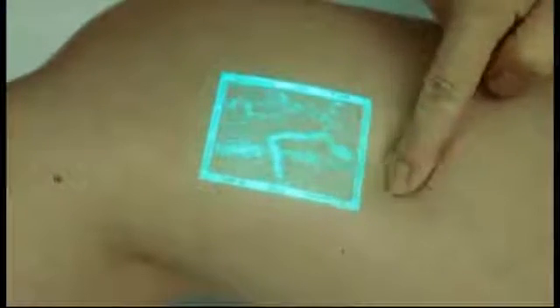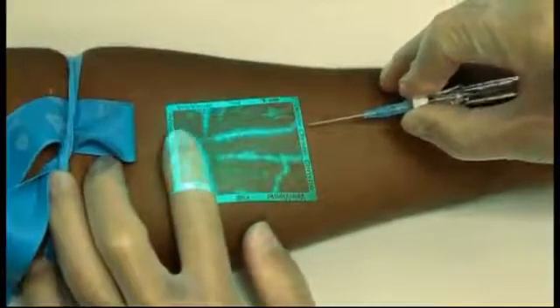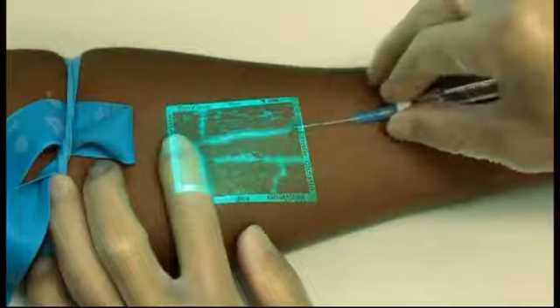The inverse mode reverses the color of the veins and the surrounding tissue inside the image window, switching from standard dark veins on a green background to green veins on a dark background. This mode is very effective for darker skin tones and any patient where visualizing only the vein image may be of benefit.